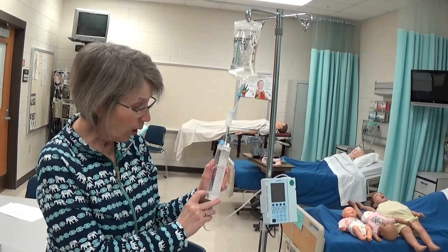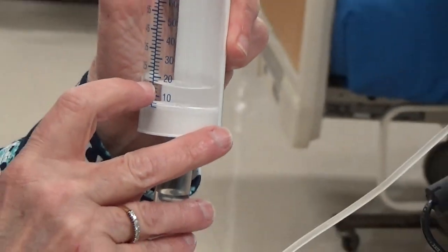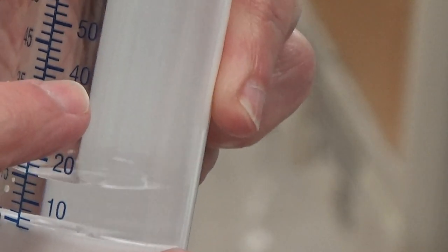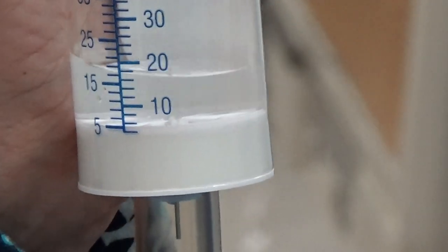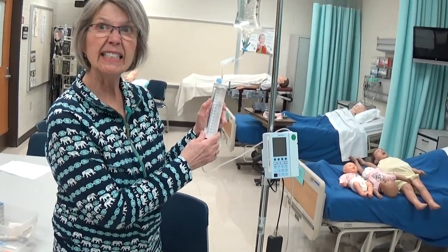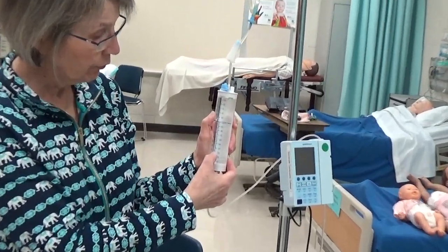We want this to be at the primary rate. So if the IV is going at 40 cc's an hour, I want 40 in here if I want it to go in an hour. If I want it to go in 30 minutes, I could put it up to 80 for 30 minutes. But I want to maintain the primary rate if possible, so I'm going to pour some fluid in here up to 40.